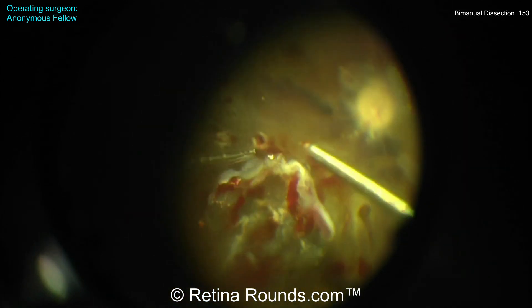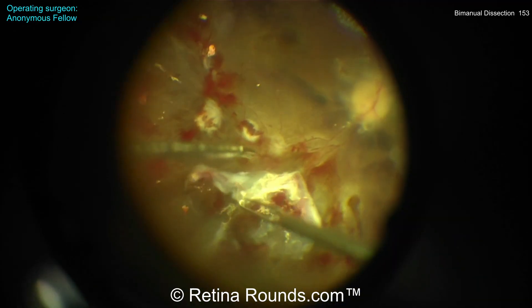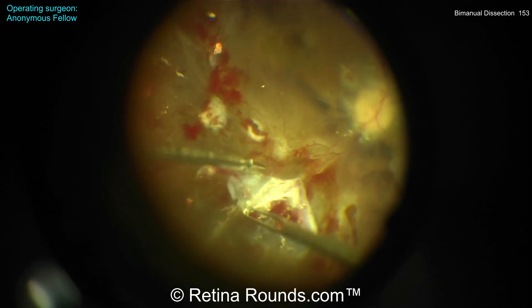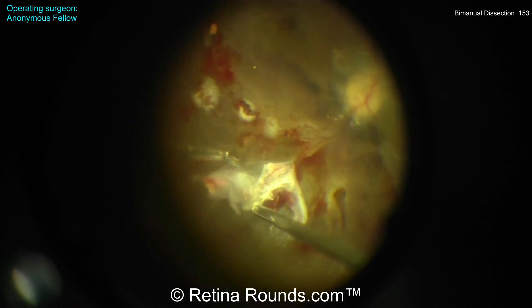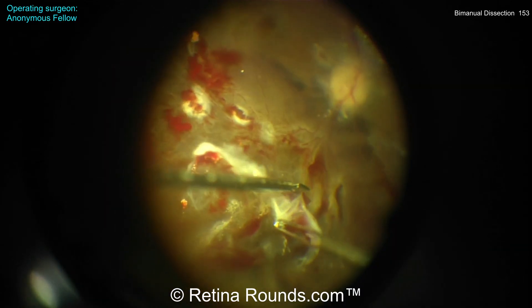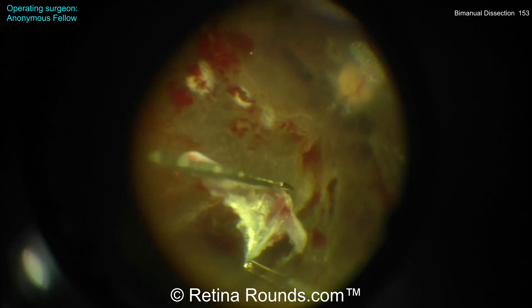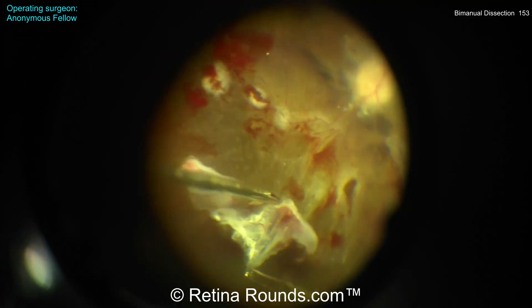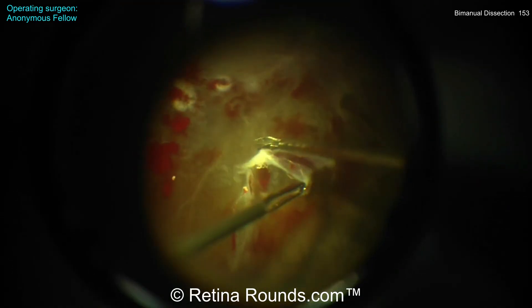Just marking some of the retinal breaks here with diathermy. Those are the posterior breaks — multiple breaks that were created on the posterior edge of this membrane because of that more vertical approach required when going posterior-to-anterior. It's much better to take a temporal-to-nasal or nasal-to-temporal approach with a superior membrane, owing to the curvature of the globe and the orientation of instruments that are more superiorly oriented.